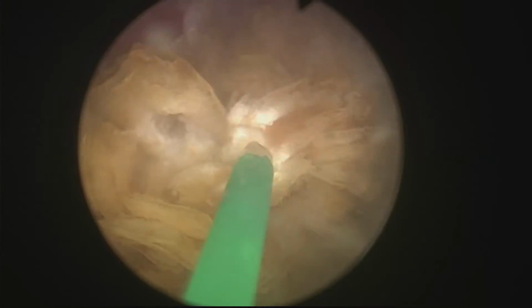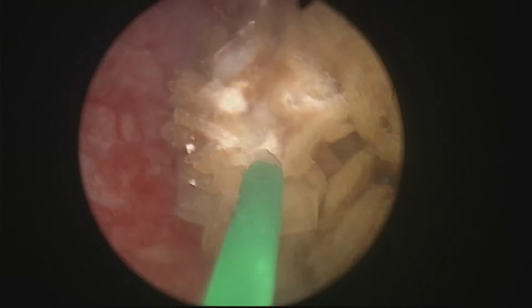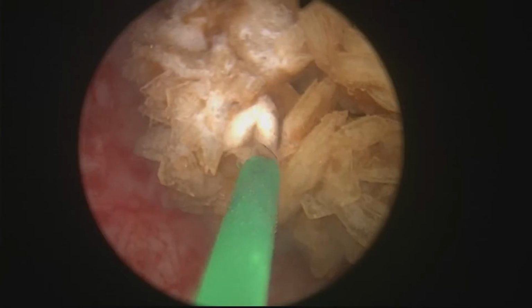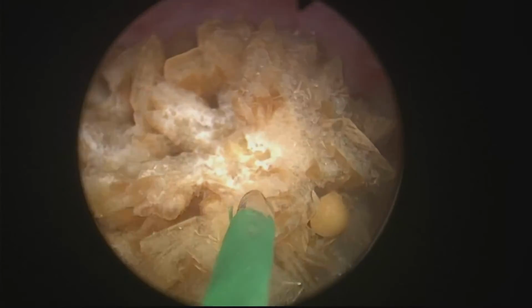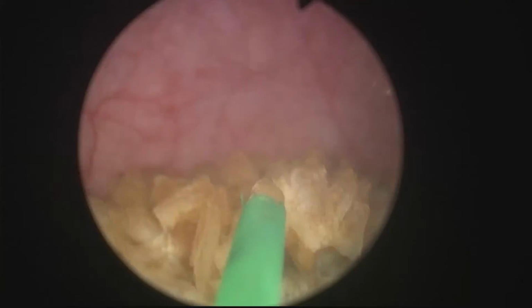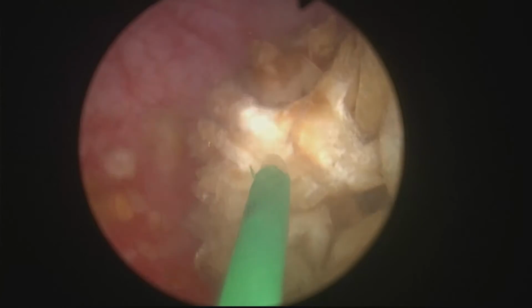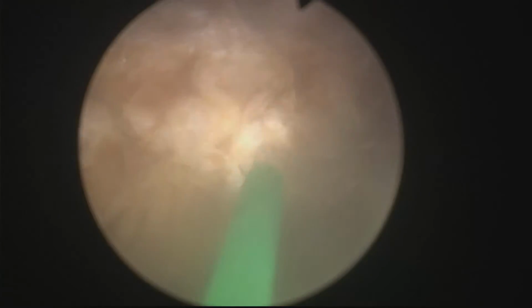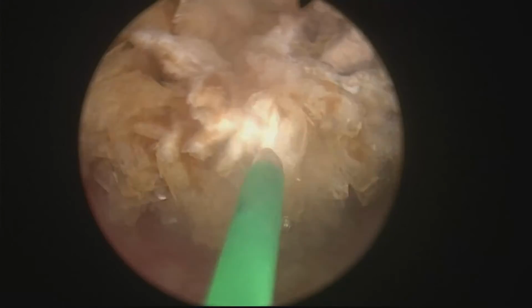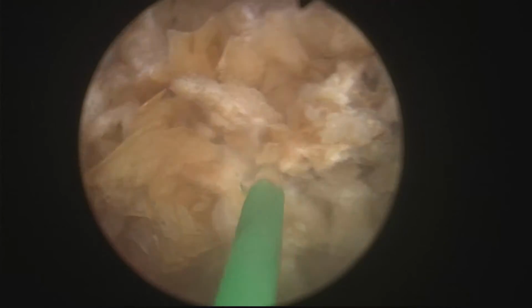He was not severely bothered by his symptoms, but I told him that these stones inside the diverticulums can cause chronic inflammation of the bladder, and that can lead to bladder tumors somehow. So I didn't feel happy to leave that there, and we discussed that if he was going to go in the operating room again, it was probably a good idea to finish the job after the TURP. And so I started to use this Moses fiber to treat the stone.